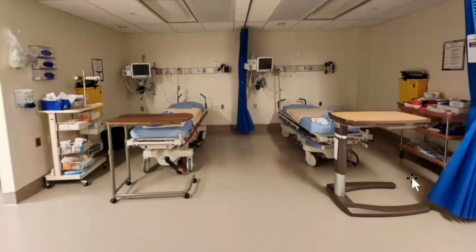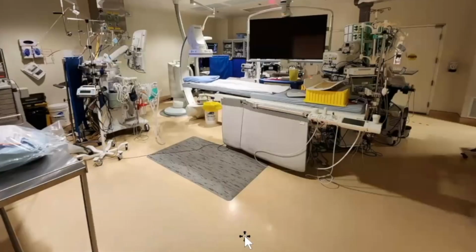So we have kind of a prep center here where you come in the morning, you haven't had anything to eat since midnight the night before. The nurse starts an IV, we go through all the paperwork, whatever else we need to do. And then you come into the lab. There's a lot of equipment in the lab, looks kind of like Starship Enterprise.